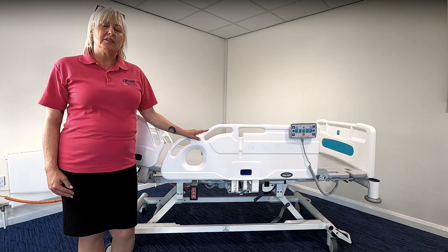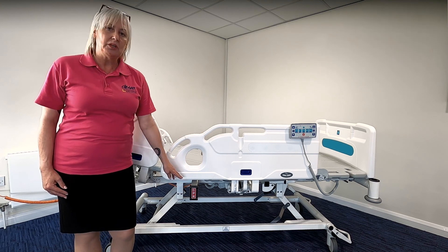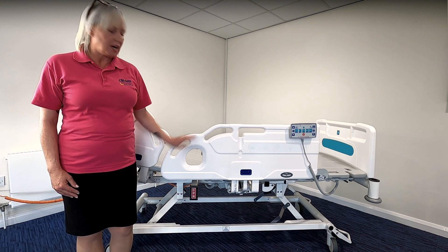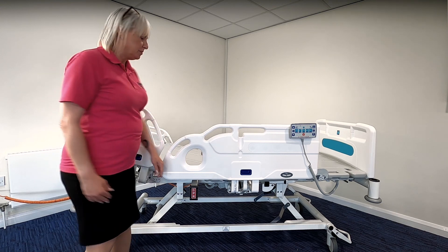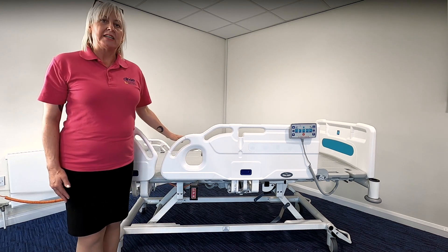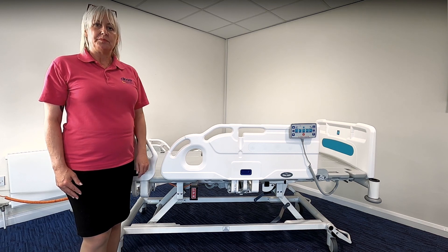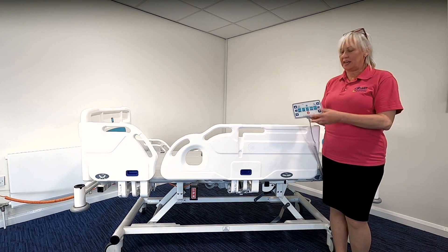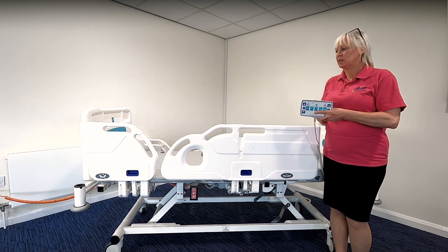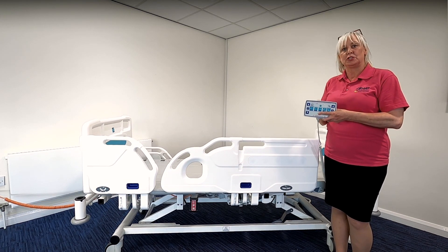The IQ bed comes with two emergency CPR functions. The first is a manual lever found on the bed — it's the same on both sides, clearly identified as CPR. To manually use the lever, pull the lever and it flattens the head of bed ready for any emergency procedures. The second CPR function is on the nurse handset — it's an electrical CPR function. By simply pressing the button, this flattens all the profiling sections of the bed and lowers it to a suitable position.